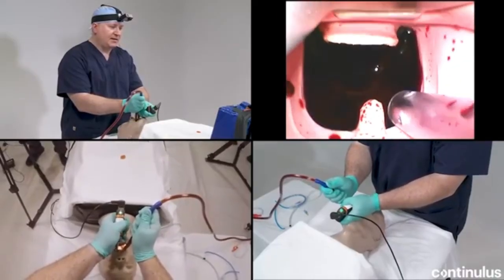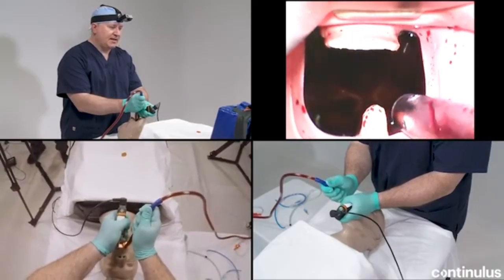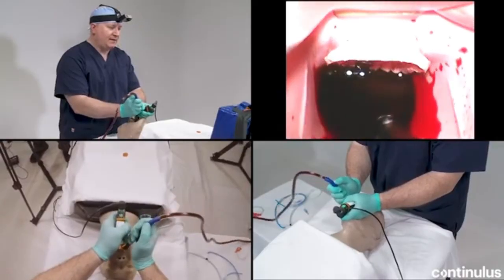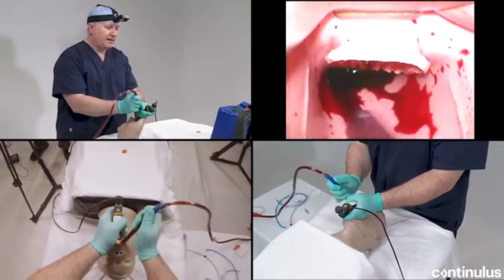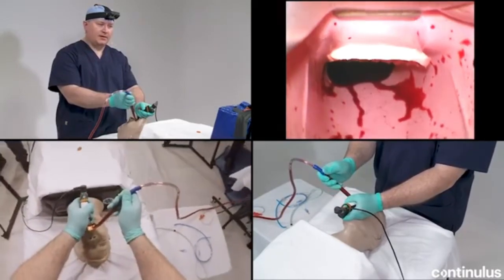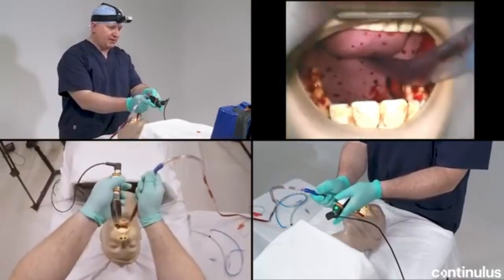As I see the tip of the epiglottis, I want to stay against the base of tongue, and I want to go into the vallecula. I'm going to drain the pharynx. Now, I didn't show you how I use the suction catheter to help me put the laryngoscope in, so let me back up and do that for a moment. James, fill her up again, would you, bud?